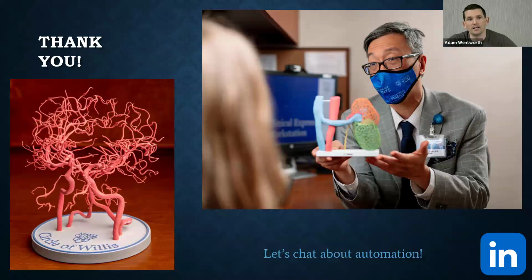I think at the end of the day, it still runs through an engineer to look at. And some of those applications handle the QA in the cloud. They do their own analysis on the meshes to start with. But practitioners are not engineers for sure. Mistakes could be made as far as choices around 3D printing technology or what have you. And they're obviously very busy people as well. So I would say inevitably it has to go through the eyes of the engineer who's responsible for the printed part to do final QA on those anyway.